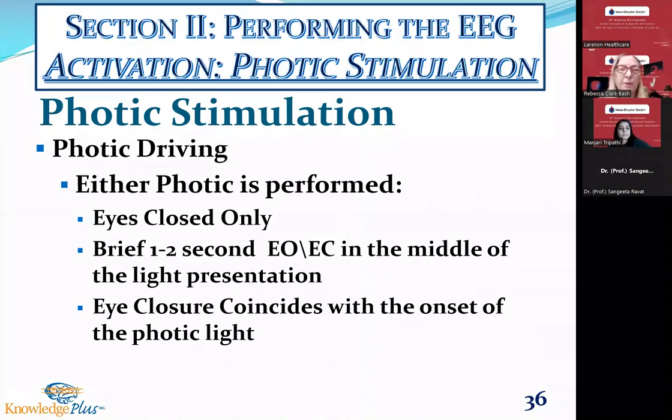I have always been a part of an institution that uses eye opening and eye closure in the middle of the light presentation. So the light starts to flash and I'll say, open your eyes, Helen, and close your eyes just for a couple seconds. And that can trigger a photoparoxysmal event.